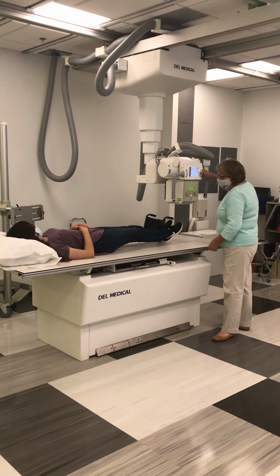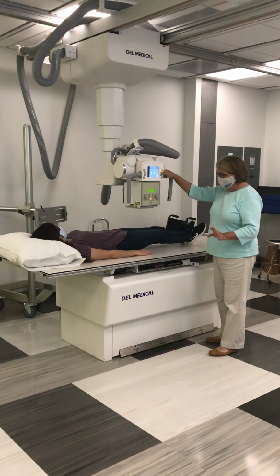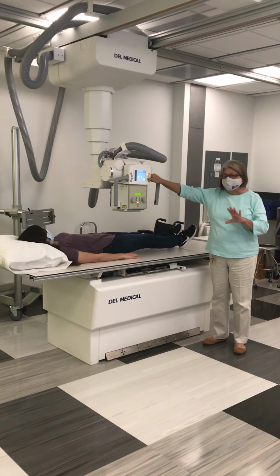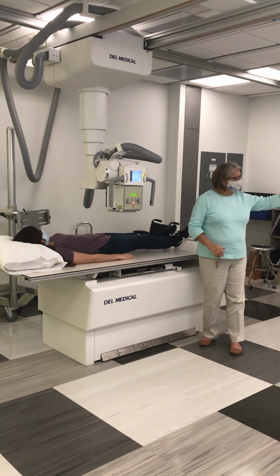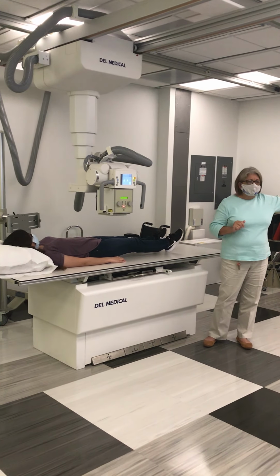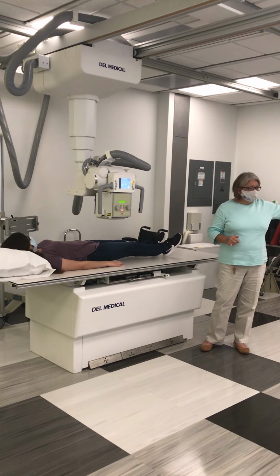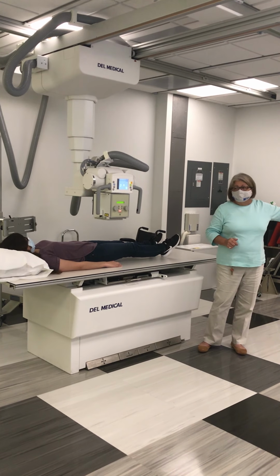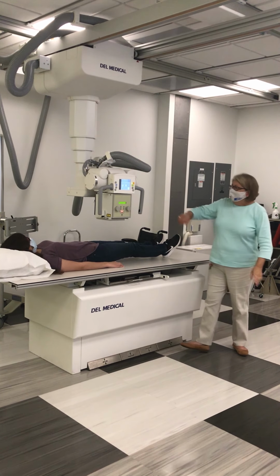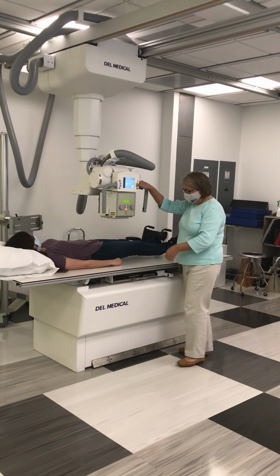I'm going to bring my tube over. Now, when we were working at the wall bucky, we had to put the tube in detent in 2 dimensions, both transversely, and we had to lock our tube in detent at the appropriate SID. It was 72 inches for the chest, and remember it was 40 inches for the AP upper airway. We don't have that detent at the table bucky for SID.